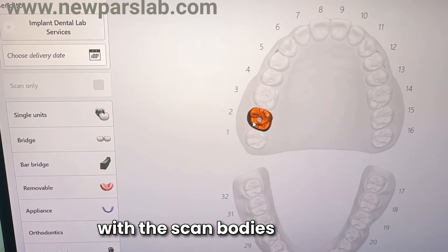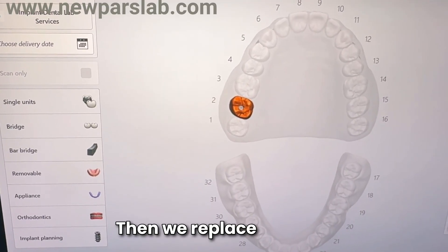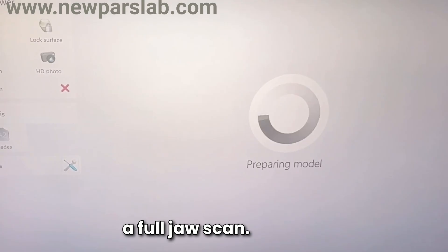We begin by scanning the jaw with the scan bodies for the pre-op scan. Then we replace the temporary denture and perform a full jaw scan.